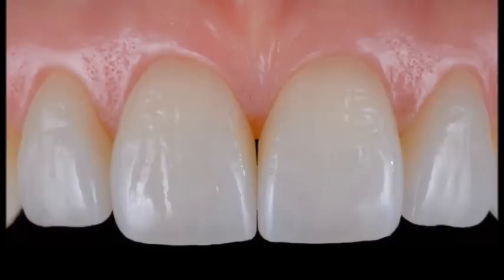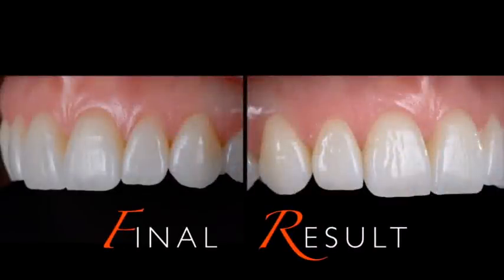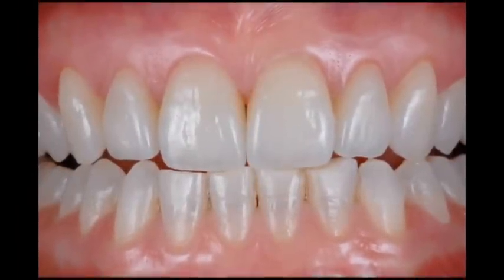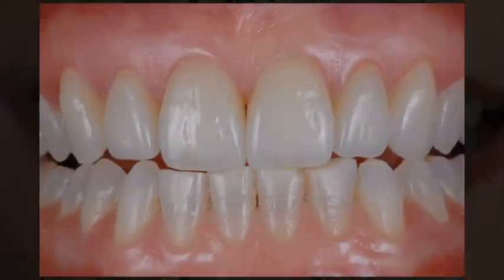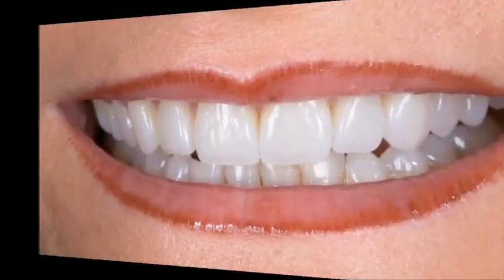Two weeks after the cementation we can appreciate the health of the soft tissue and the mimetic result obtained. With this technique, the patient can be aware of the aesthetic outcome and can interact with the clinician during the treatment plan.